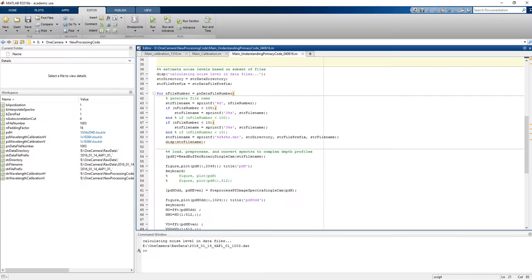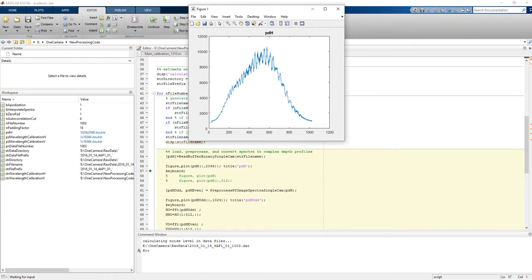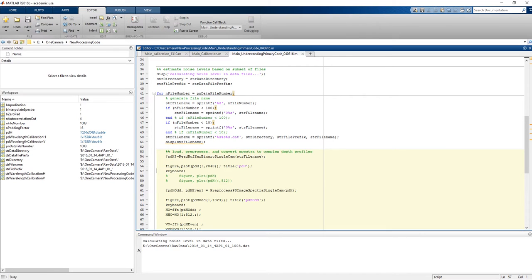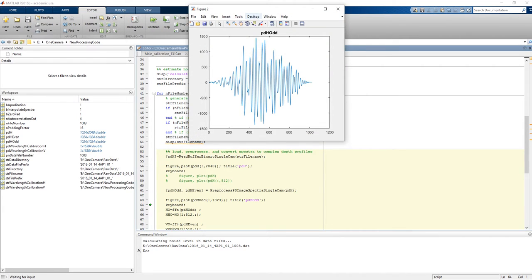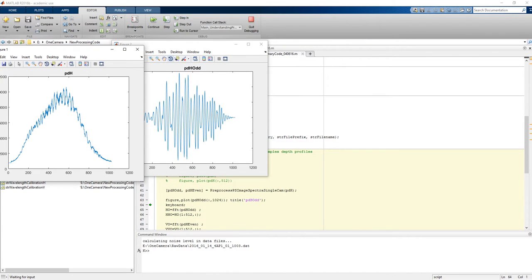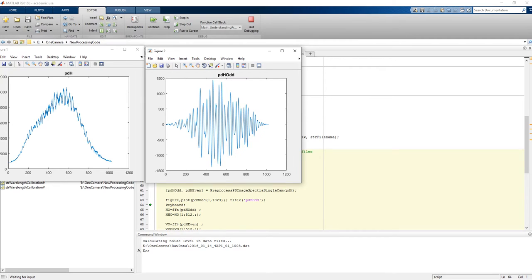We can see this from the code too. Say if I run this code, firstly I am just detecting the interference pattern. Then if I go forward and subtract the DC part from the image, we can only capture the interference part of the image. This is the useful part.